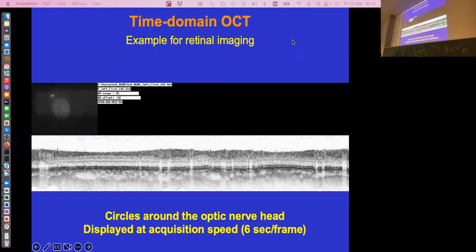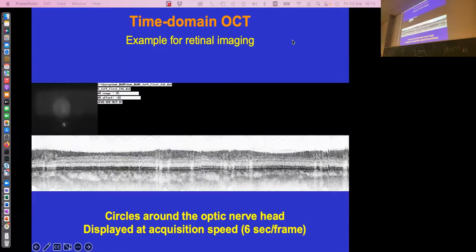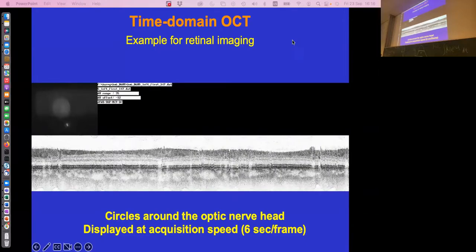The problem is that you get motion artifacts. I challenge you to keep your eye open for a minute. You think it's easy, but after 30 seconds, you'll realize it starts to itch and you're going to blink. My timing is right in the next slide. There's a blink.